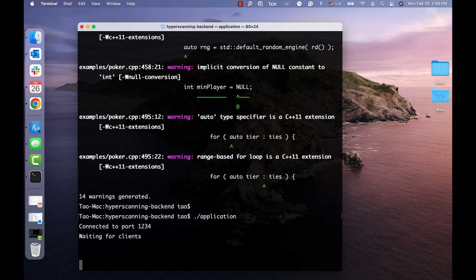Parameters are divided into shared and local categories. Shared parameters are synchronized between two clients to ensure that the same experiment is being run for each subject. Some example parameters are the stimulus sequence or the background color. The shared parameters should be stored on the server computer as a parameter file and sent to each client when it connects to the server.